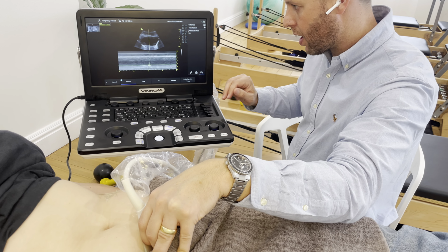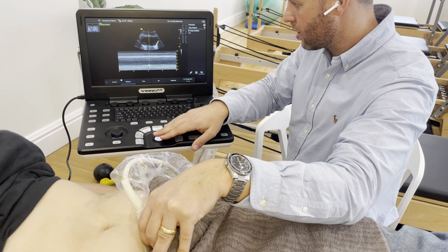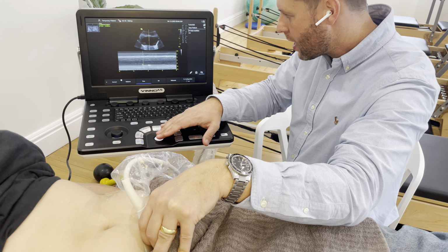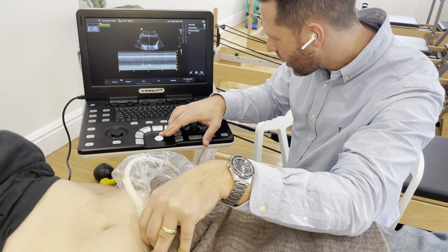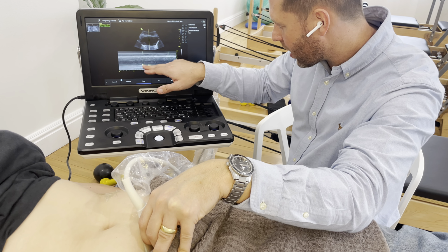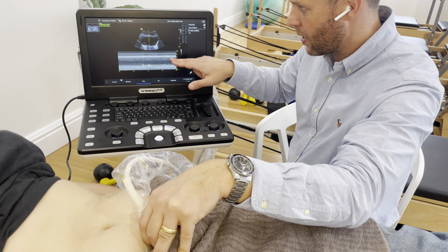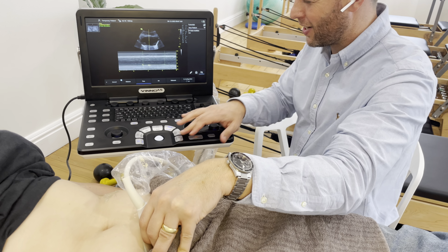And in terms of the time, it only lasted, so we did distance, we can do time as well. So I'm going to come down here and choose time. And that's the horizontal measurement. So this was the start of the contraction. And I can see that it dropped off about here. There it is, because I've got my green line coming across, so I can see where the white line drops away from it. So I'm going to go back to the last time those 2 points met. So 3,000 milliseconds, or 3 seconds.